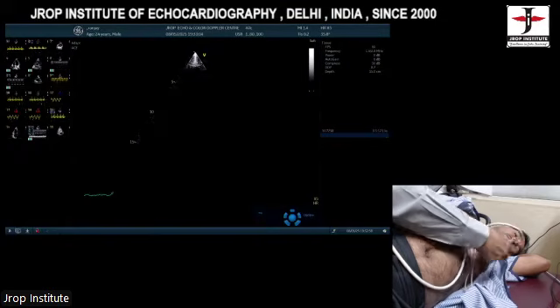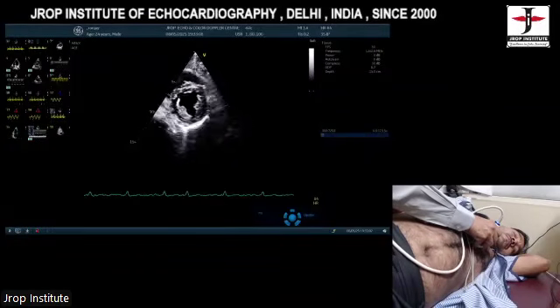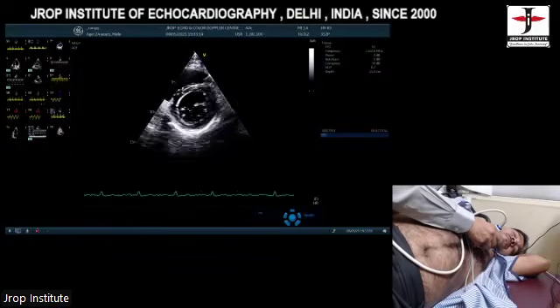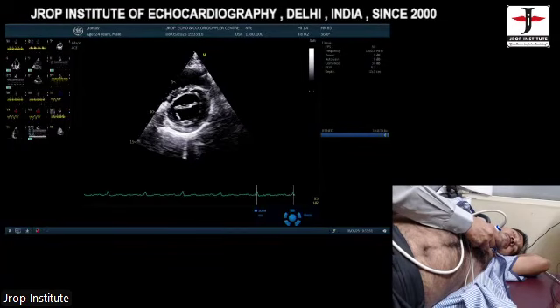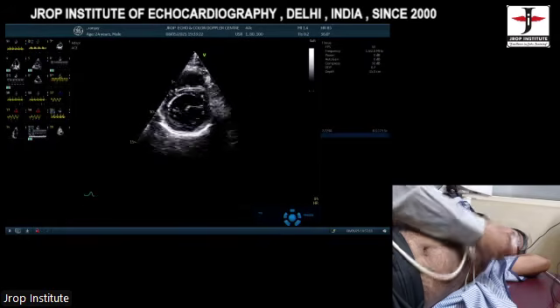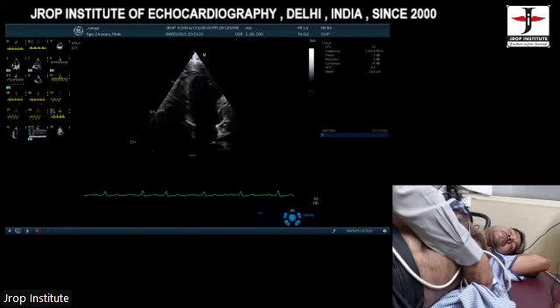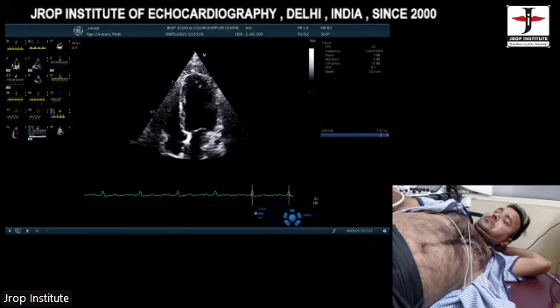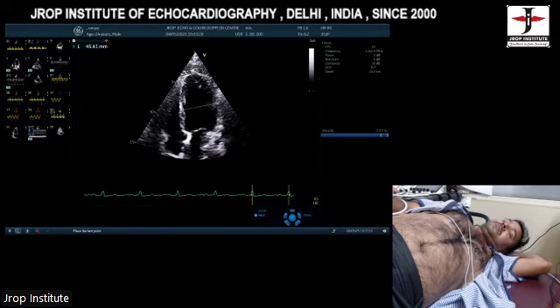Second, your question was, I said go to the papillary muscles level, then gradually come towards the aorta. So in between, what you will find is the mitral valve leaflet tips. Why this? The answer lies in the 4-chamber view. If I go to my 4-chamber view, I'm cutting at this level in the papillary muscles, correct?